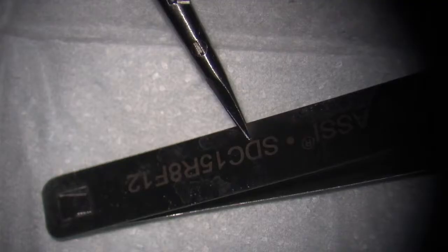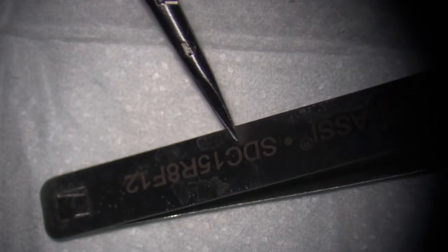This is not a super-fine one. We have a super-fine scissor. Looks nice. Yeah, but we can read the information here. S is scissor, D is dissection, and then curve. 15 is the length in centimeters. R is round, and 8 is the diameter of the round.